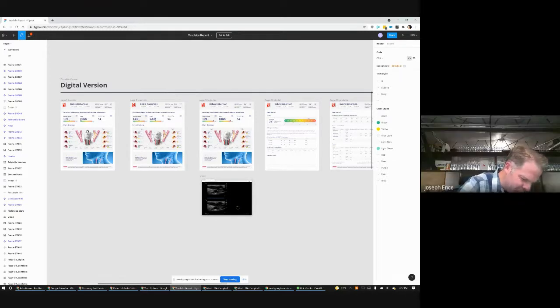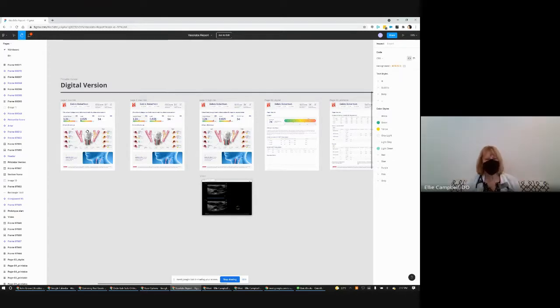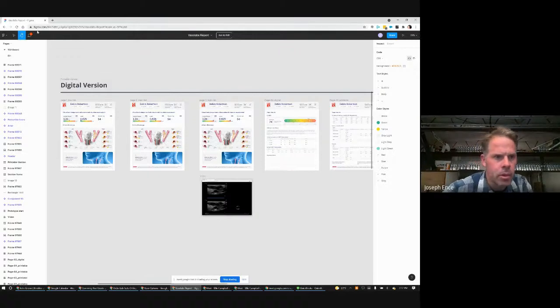For me, the serial readings are almost more important than the data point in time. Let me put a note right in this right now.